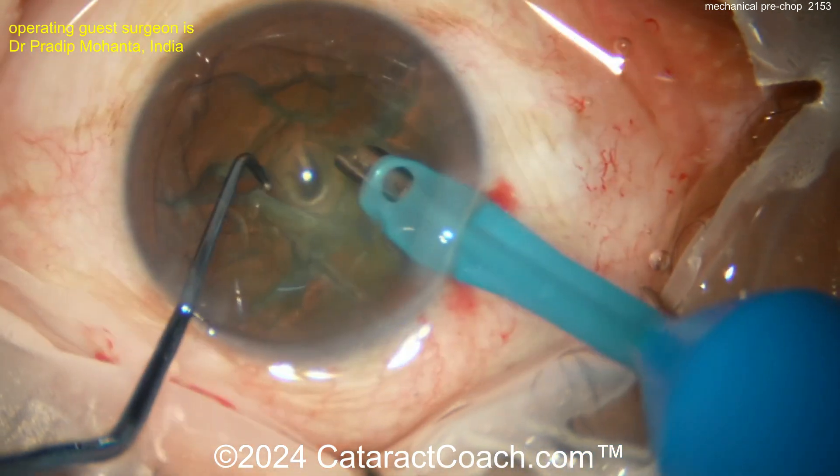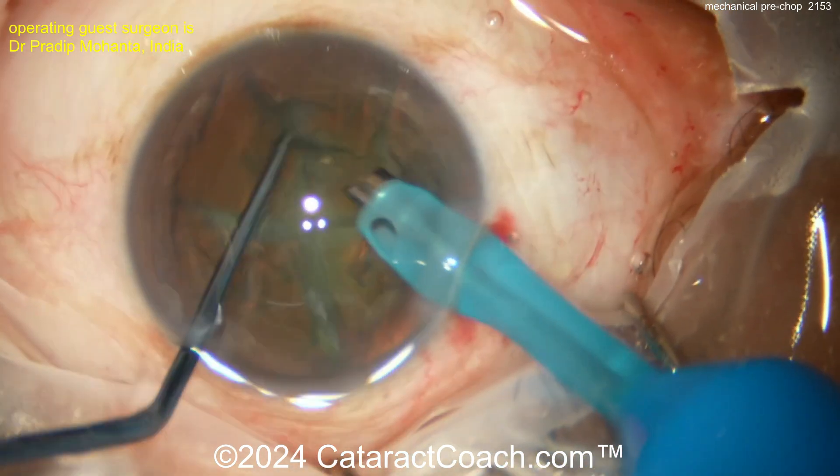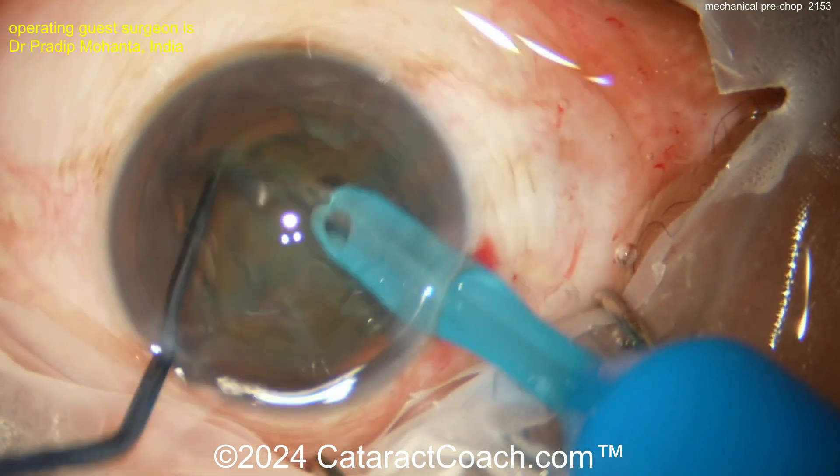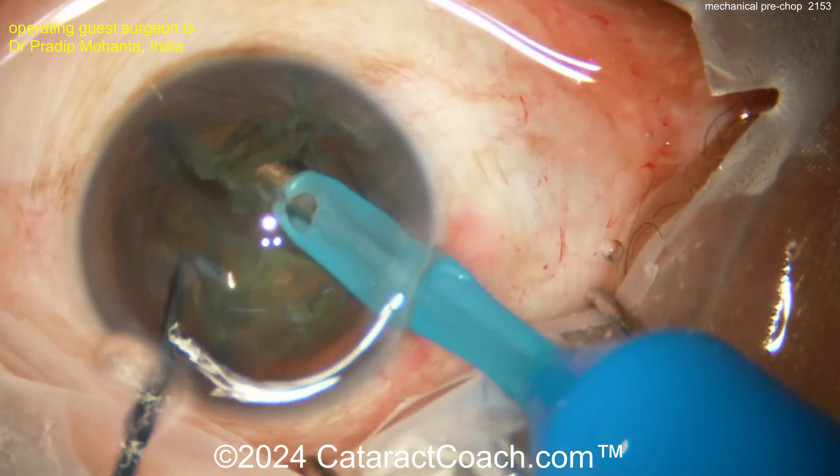Now rotating the nucleus back and forth, loosening up the cortex — maybe a little Rosatelli spin there. Now it's time to remove the nuclear quadrants. This pre-chop technique is very nice and looks like a very safe way of doing it.